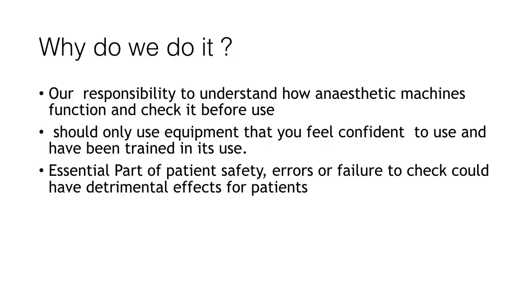So why do we check the anaesthetic machine? It is our responsibility to understand how the anaesthetic machine functions and check it before its use. We should only be using equipment that we feel confident to use and that we've been trained to use, and it's an essential part of ensuring the patient is safe when we deliver an anaesthetic, as by checking the machine beforehand, we can avoid errors that occur from faults within the machine, which could have detrimental effects for patients.